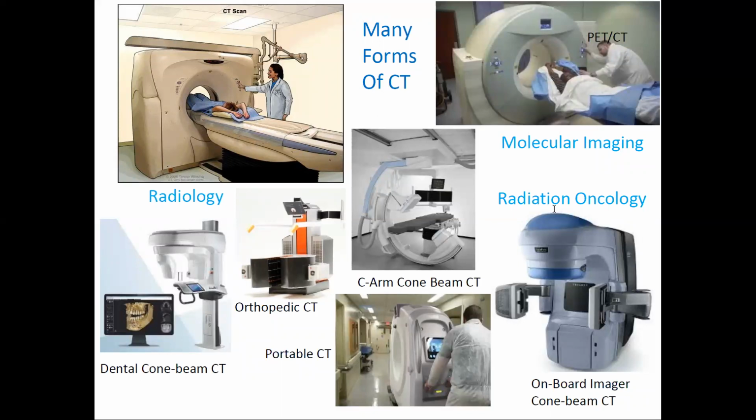And the cone beam is, from an instrument designer's point of view, a lesser version of what you get with the big, solid, costly, high performance, high-end CT. And portable CT is somewhere a little bit in the middle, but it's more like the real CT. I shouldn't say not real CT, but cone beam is perfectly good and making it better given what you have, living within the constraints of extra scatter, a little bit less good mechanics, less power, various things. You get what you pay for to some degree, or you're constrained at what you can offer given the cost that's going to be affordable for a particular application, what's appropriate.